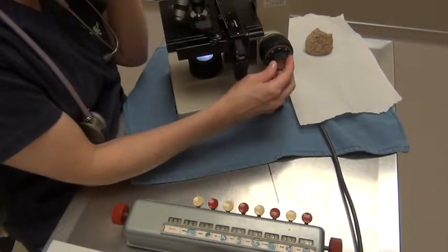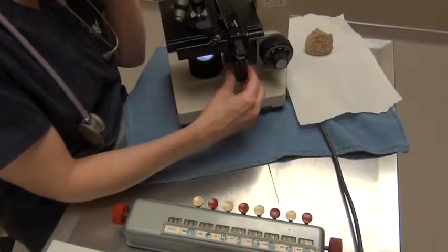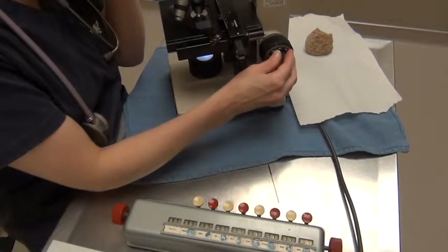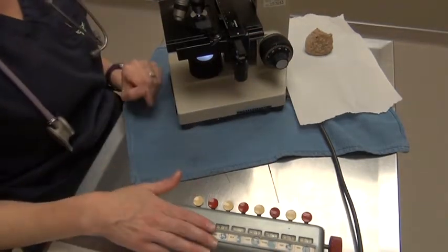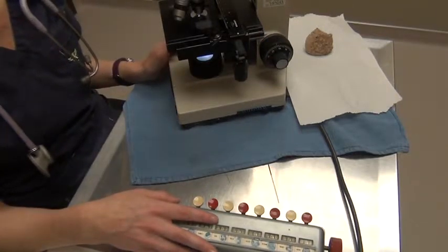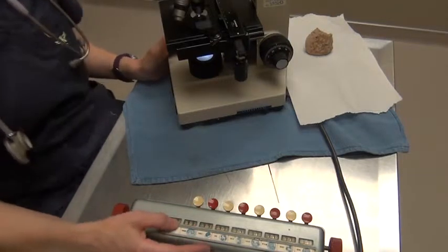When you get to the feathered edge, there's all that clumping and there's a bunch of spaces where you don't see anything, so I need to find where I have kind of uniform coverage and begin looking. So what I'm going to do is I will count per 10 fields. I'm going to count my platelets, and then I'll find the platelet estimation.